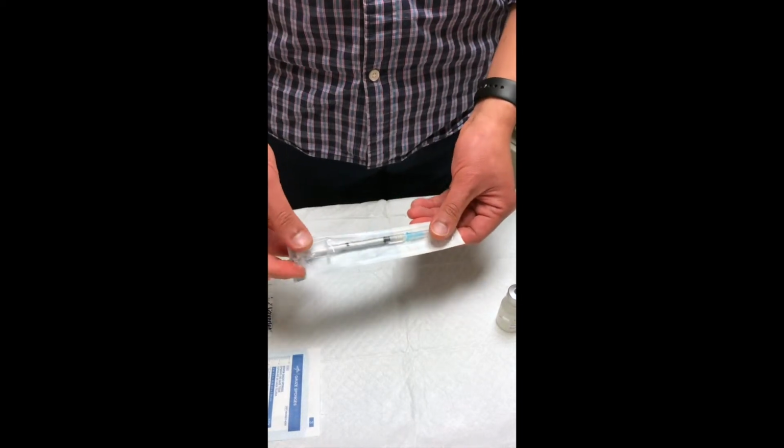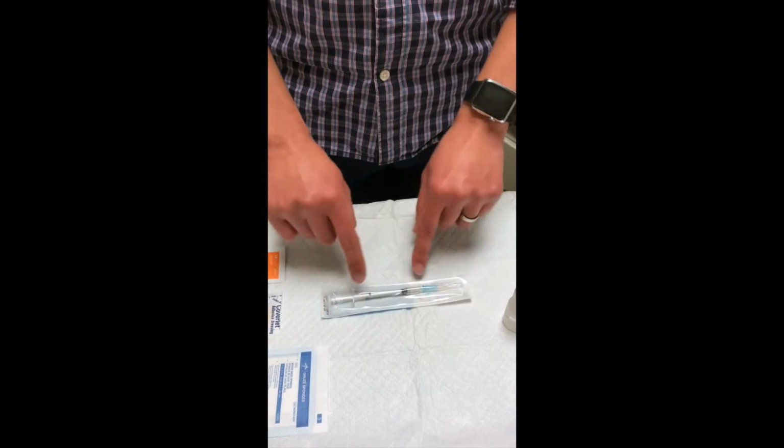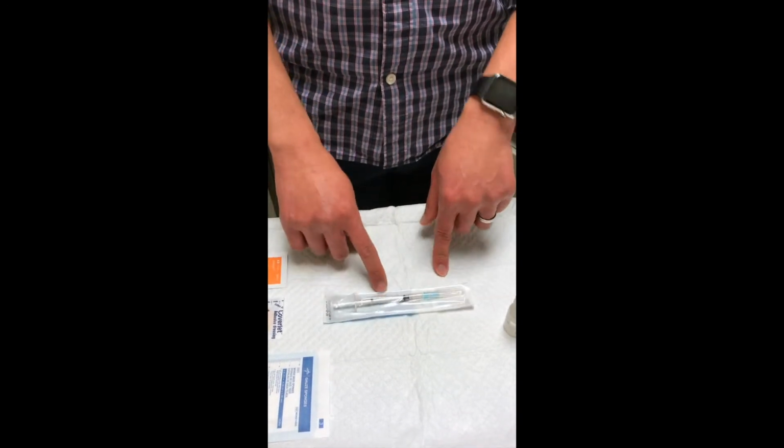Now you can prep your injection site. So let's talk a little bit about that. And while we do, I'm going to put this aside, leaving my needle and my syringe in the plastic wrap, that way it stays clean. Let's talk a little bit about preparing your injection site. The idea with the subcutaneous injection is that you want to inject into the fat tissue. So generally, places where there tends to be more fat works perfectly well. So the belly tends to be a safe bet.